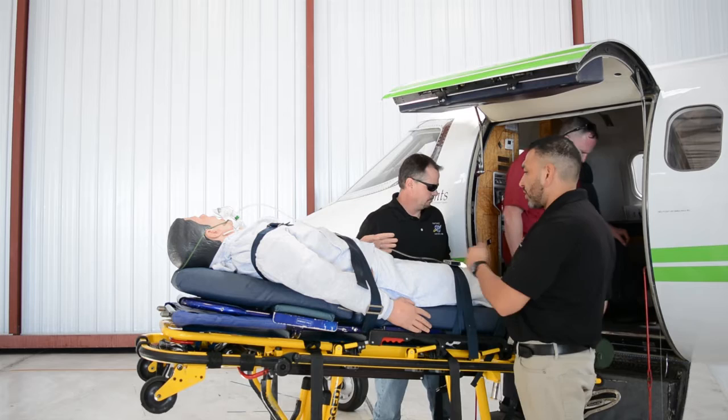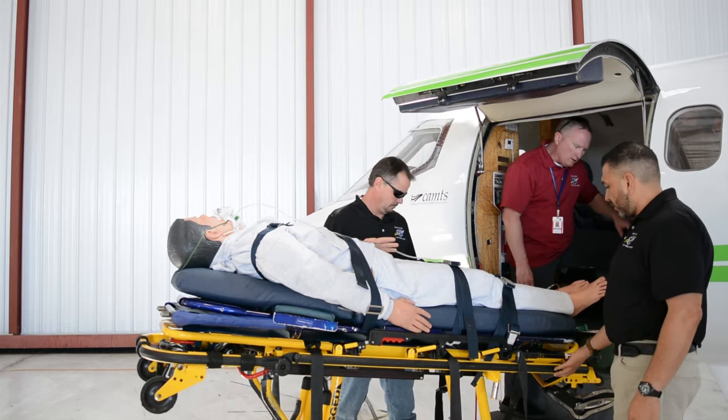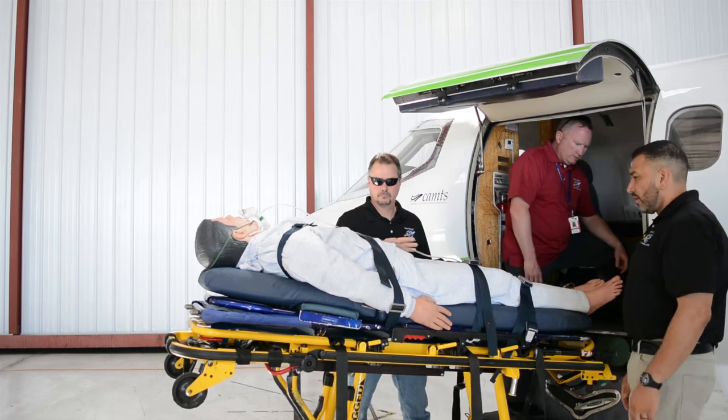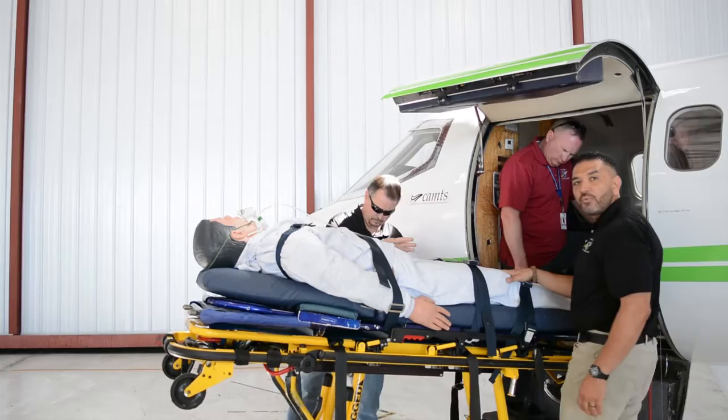The gurney, as you can see, is in the upright position, so it's all the way as high as it can go as far as loading. And we are at almost a 45 degree angle to the door. That's always a good practice because we're going to be loading at an angle going in on the sled. So once we have this position, I like to put a foot here by the wheel to make sure that I'm keeping the gurney stable.